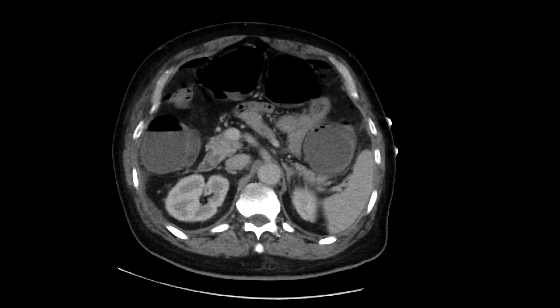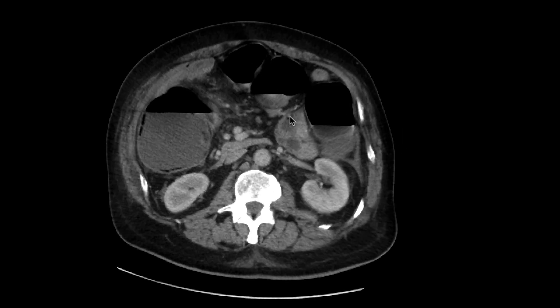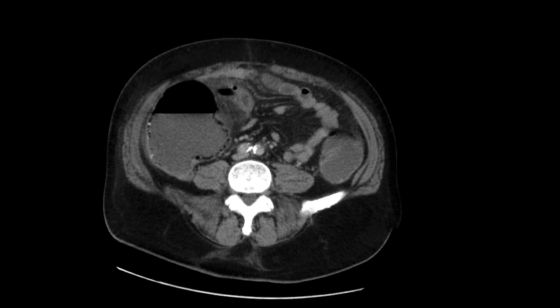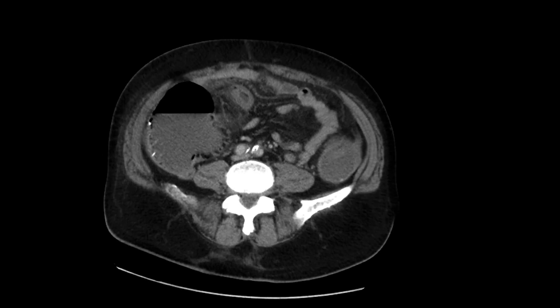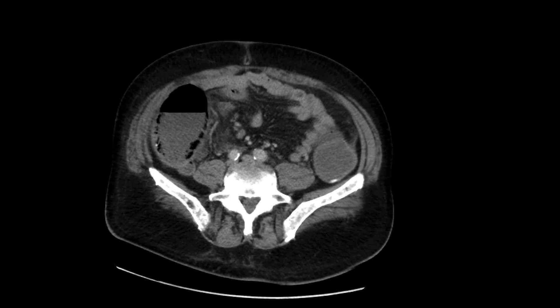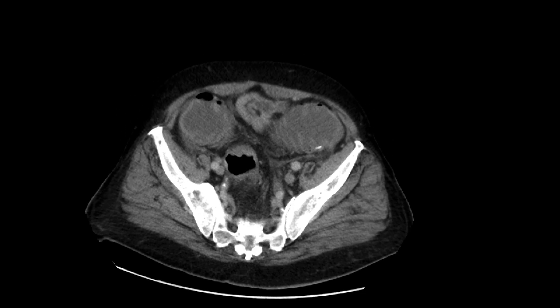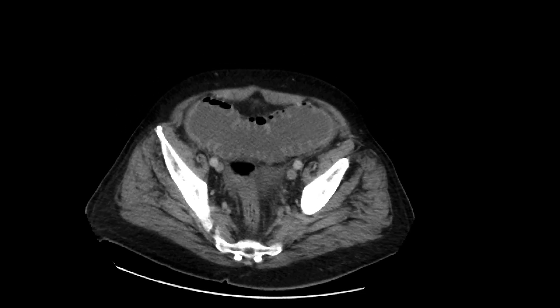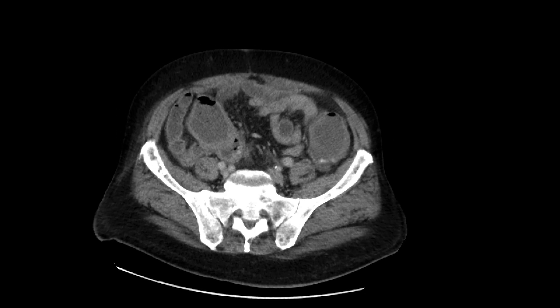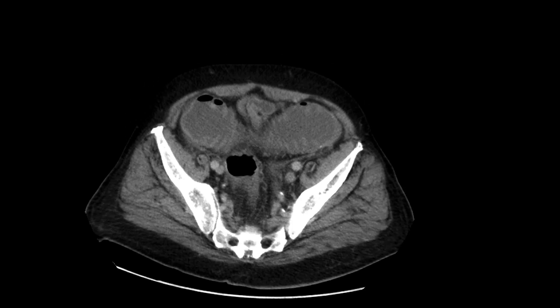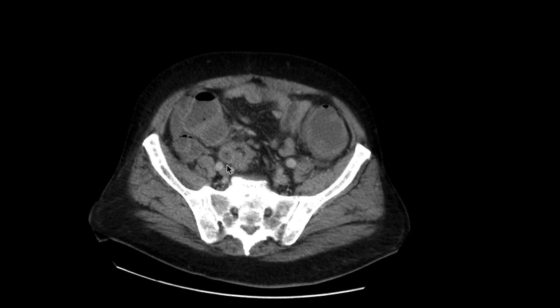So let's handle this issue by issue. If we just follow the large bowel, there are numerous fluid-filled loops of large bowel, so you'd be worried about a potential obstruction. You can see the descending colon here — fluid filled, distended. Going over here, the sigmoid colon is also distended. As we go downwards, we can start to see there's almost an abrupt narrowing right around there of that sigmoid colon.